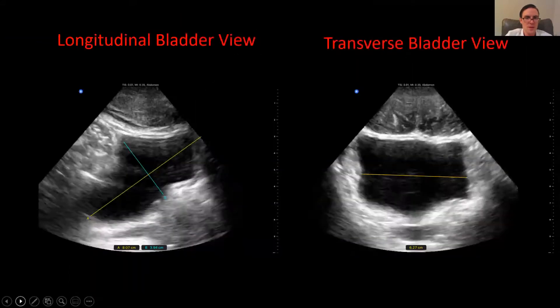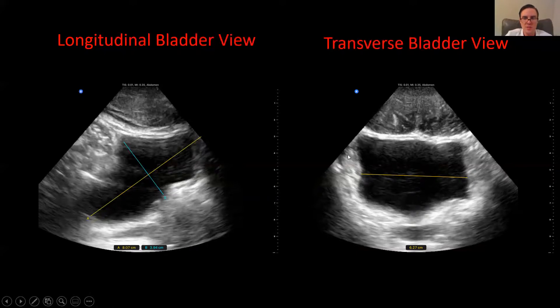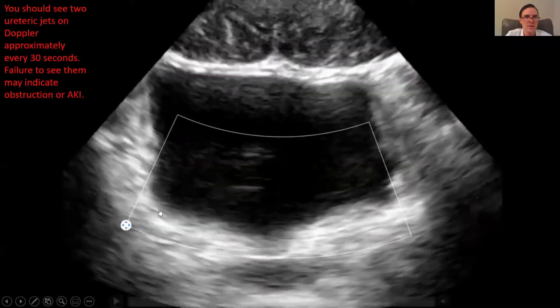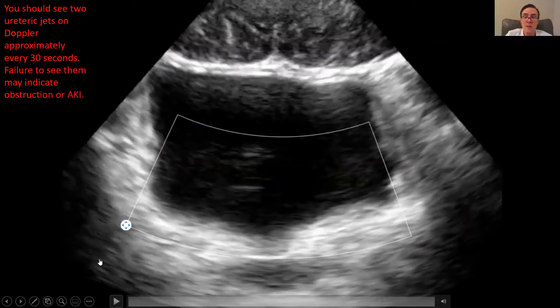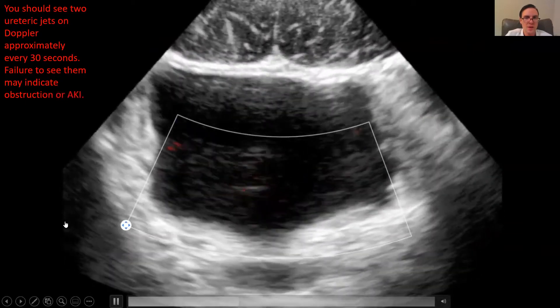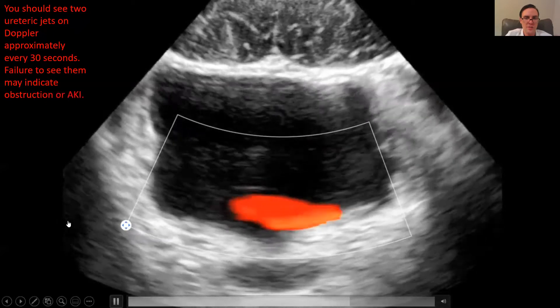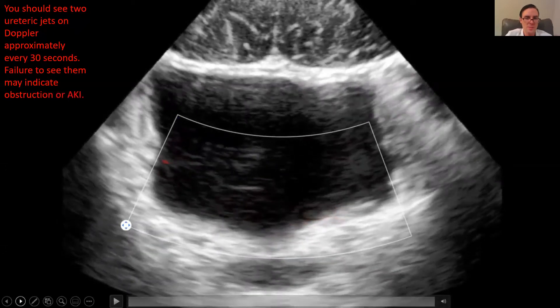Here are pictures showing the different views. The longitudinal view of the bladder goes up and down right across the midline, and you can take measurements from top to bottom and front to back. The transverse view is side to side. For ureteric jets, these should be happening approximately every 30 seconds or so — if you don't see them, that could mean there's an obstruction on one side, an AKI, or something like that, which is a reason for concern. With the Doppler on, you can see a little red jet shooting out — those are the ureteric jets on both sides.